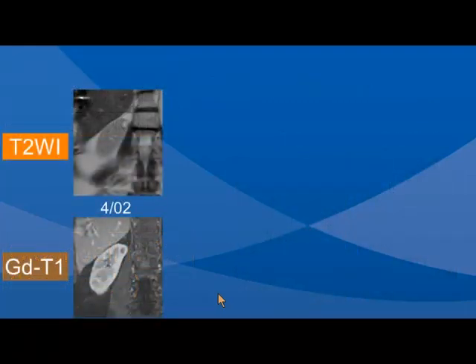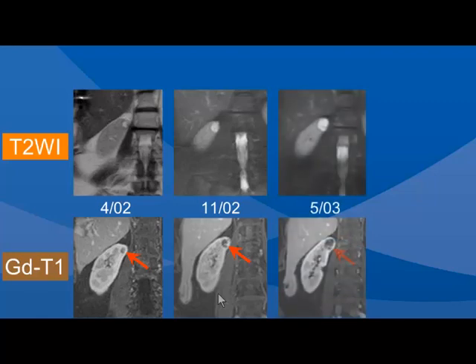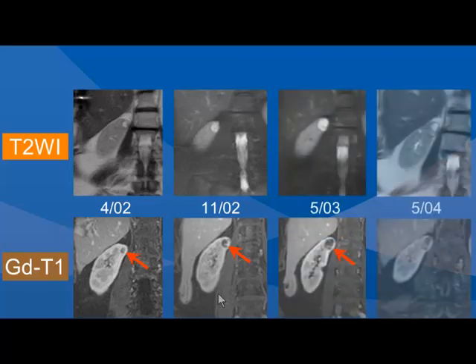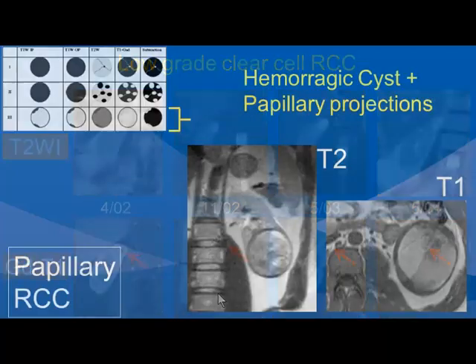And this is important because these are very low-grade malignancies, particularly when you have very small amounts of solid components like I showed you before. So you can follow these lesions over time. That's why making the decision between a Bosniak IIF versus 3 is not necessarily that critical. You can still follow them in 6 months and see if they grow. This patient actually refused surgery for a while, and eventually we were pretty certain that this was a neoplasm, and she got resected. It was a low-grade clear cell, and she didn't have any problem afterwards. So again, the risk of metastasis in this particular phenotype is extremely low.